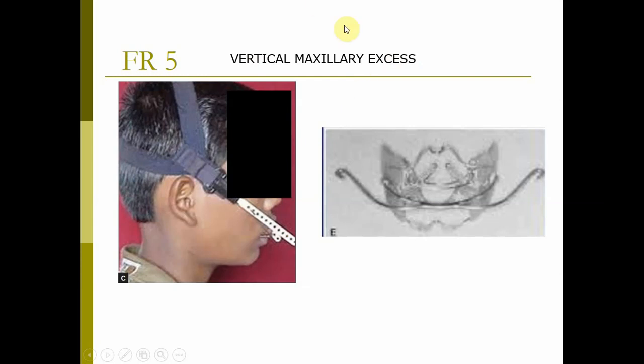Okay, so this is actually a combination of myofunctional appliances with your orthopedic appliance, where you are applying heavy force to redirect the jaw bones. This is your head gear. So this is a Frankel appliance combined with your head gear.